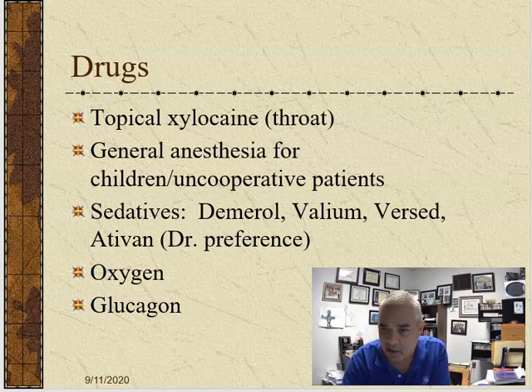Old school sedative here is Demerol. Nobody uses that anymore because it turned out a lot of people were allergic to it. But we do use Valium, Versed, Ativan, other drugs too. Stuff that'll just kind of keep the patient nice and calm and semi-conscious. And we need oxygen on the patient, and we also need glucagon available.